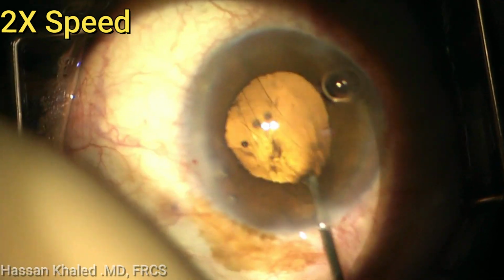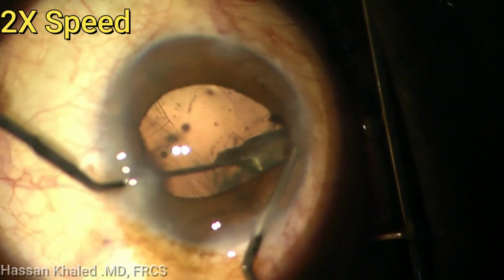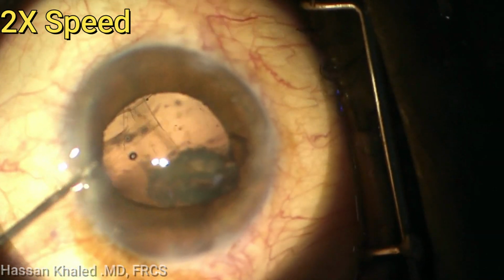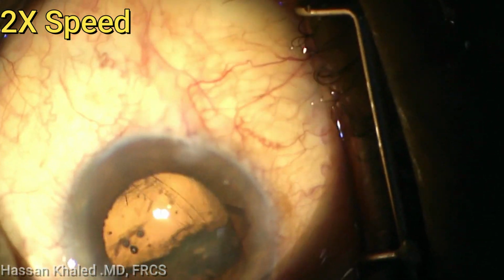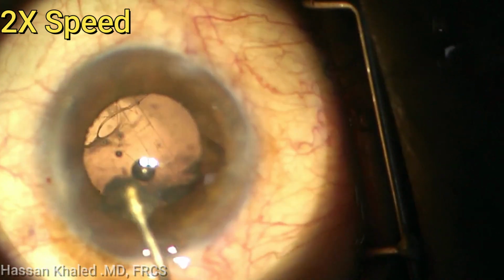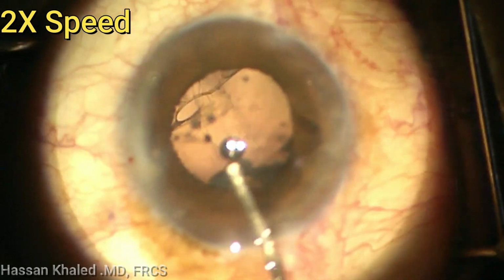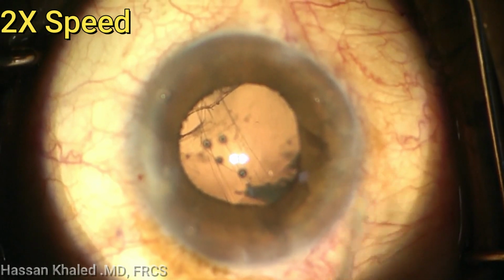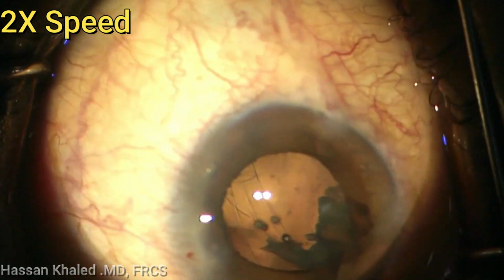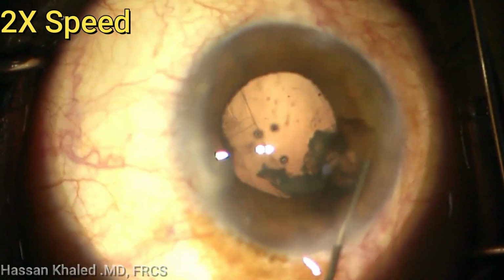Now I change to remove the cortex with the large cannula connected to a 5 cc syringe. You can see here a large piece of the cortex was heading opposite of the capsular rupture behind the iris. So I use the Sinskey together with the chopper to push the iris and get this cortex to be at the plane of the iris or in front of the iris to remove it with the large cannula connected to 5 cc.